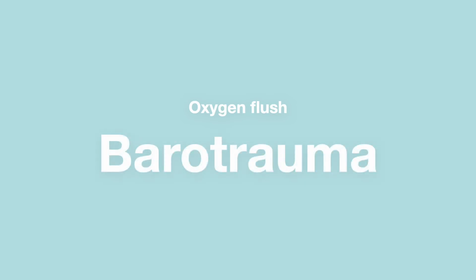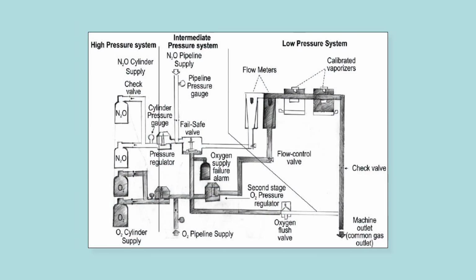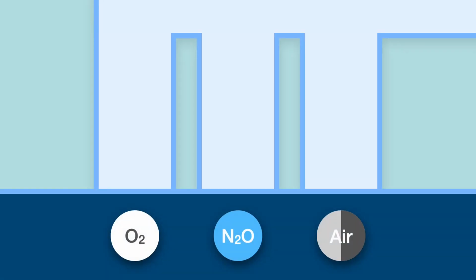Speaking of flow and its control, I want you to look at this image again and spot the flow control valve and the flow meters. So this is basically a representative image. Actually how it looks is like this. So we have these knobs, as you can see in the bottom. These knobs are how we control the flow. So this is flow control. And we have got these tubes which we call flow meters. And ultimately the gas moves out.